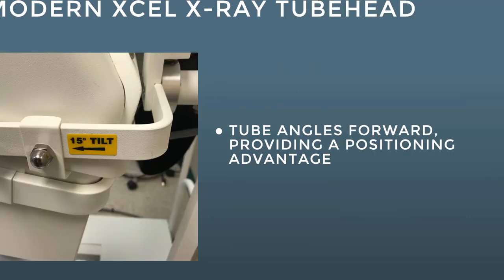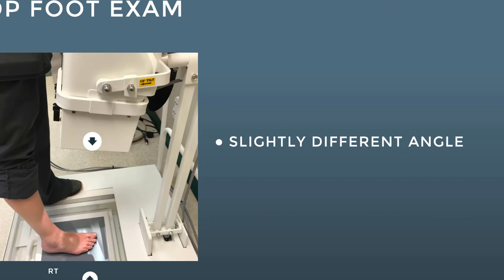From the side, this camera automatically has a 15-degree tilt, which conveniently prevents you from having to turn the patient sideways. Some older units require the patient to stand sideways to achieve that 15-degree angle. With newer systems, some cameras only shoot straight up and down — in that case you can position the patient's foot at an angle to achieve the same result.